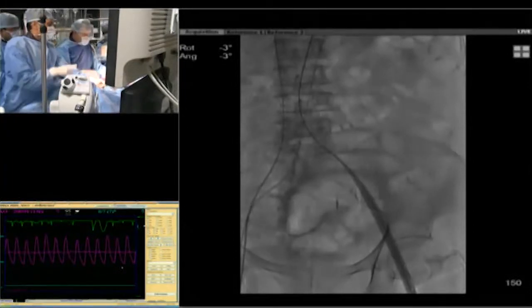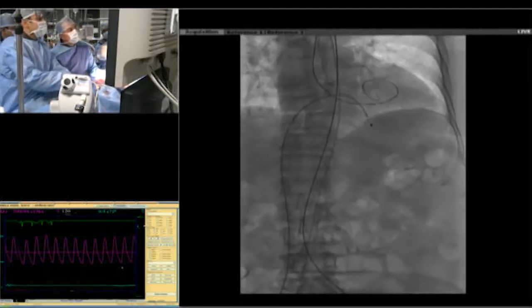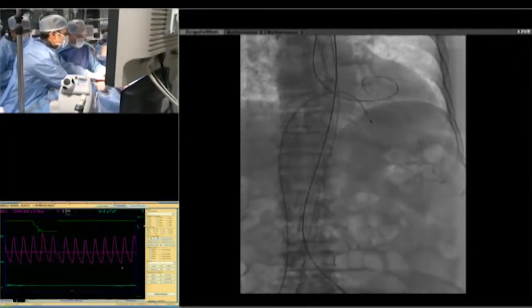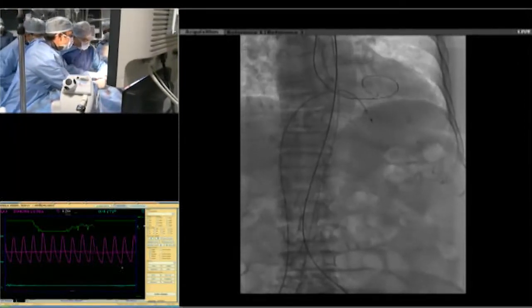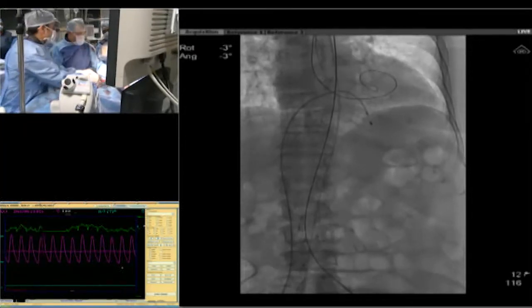What we'll do is show us the wire and the LV. All we need to look at is the wire and the LV. We'll try to remove the dilator from here. Okay, so you do it. And then I'm holding the sheath, and then you'll have to close it. Somebody will have to hold the sheath all the time. I'm holding.